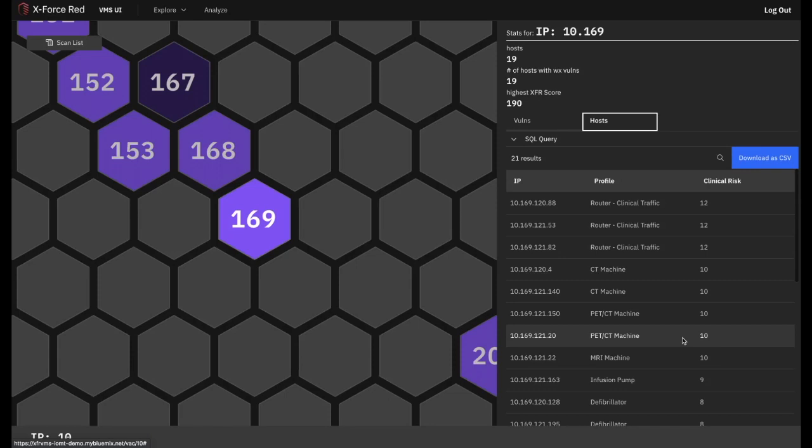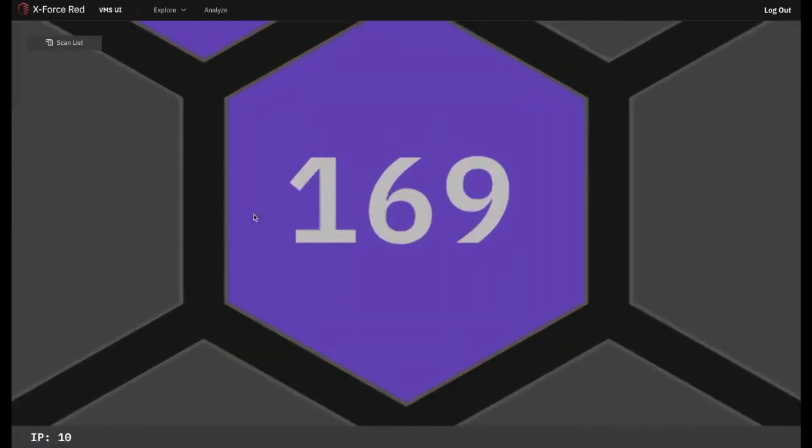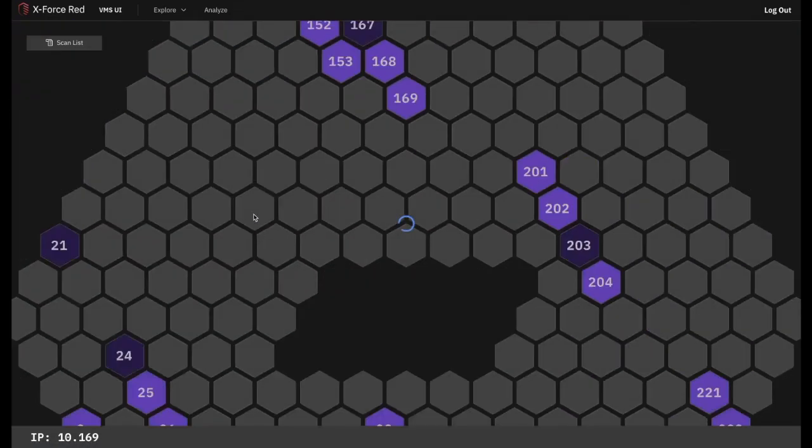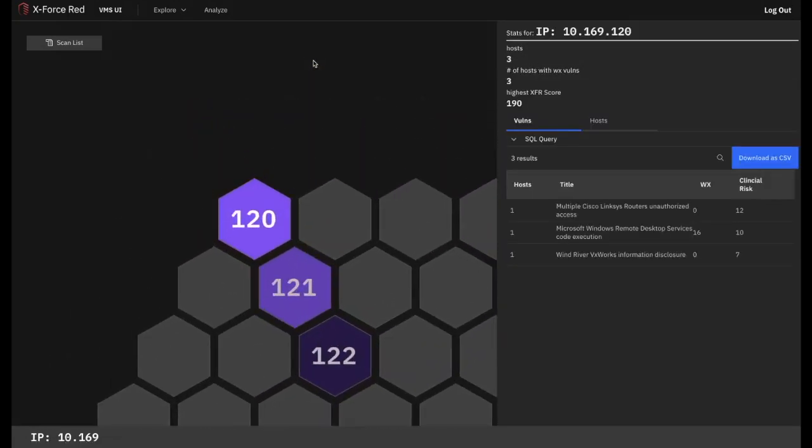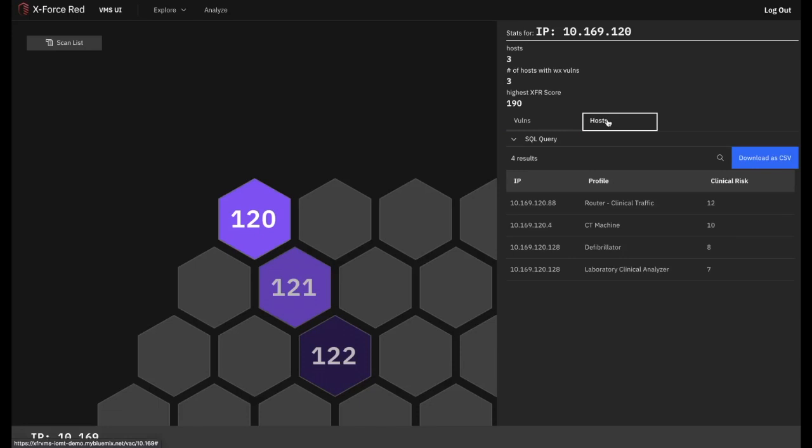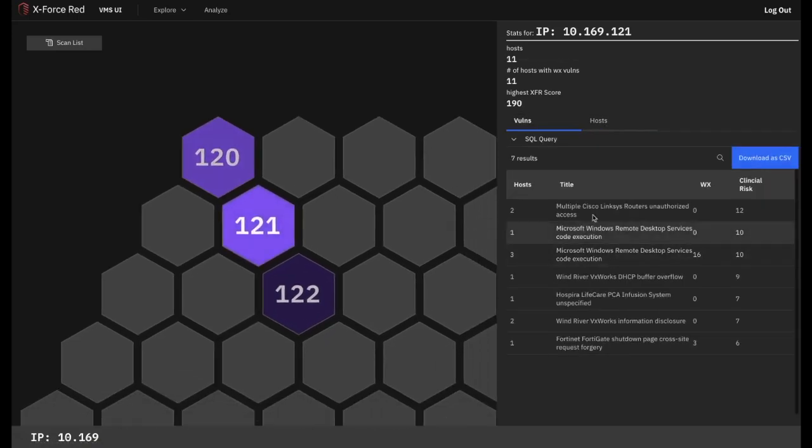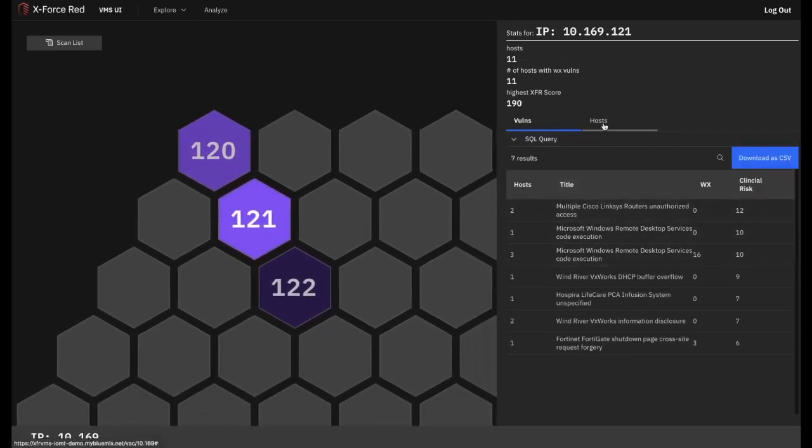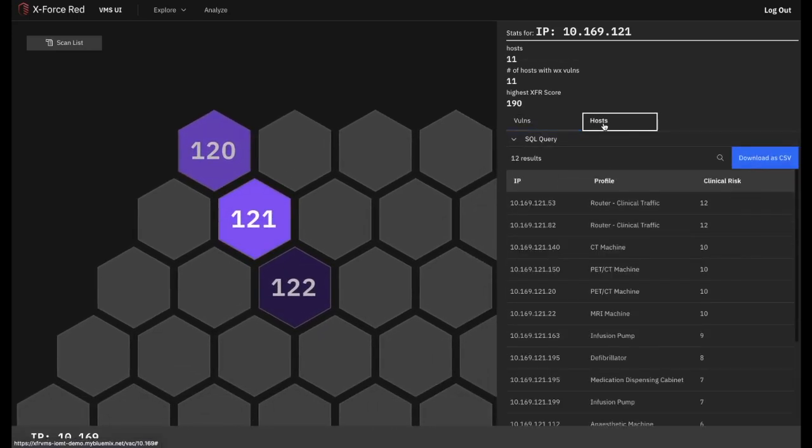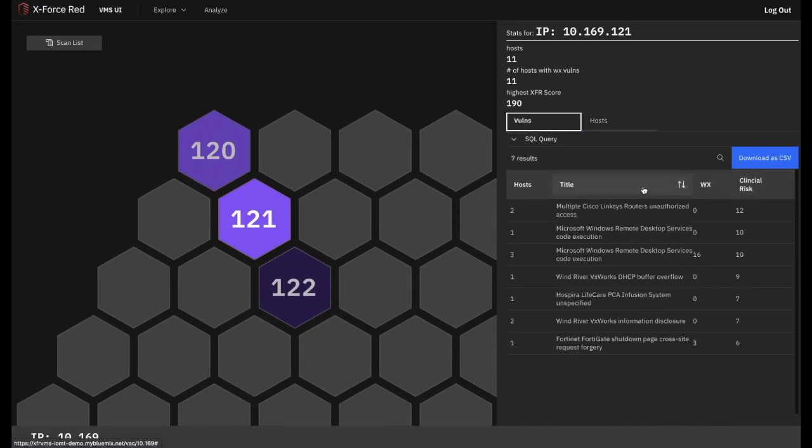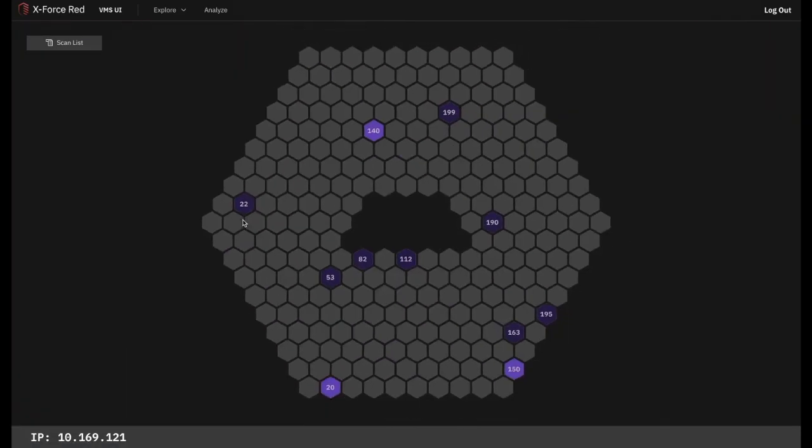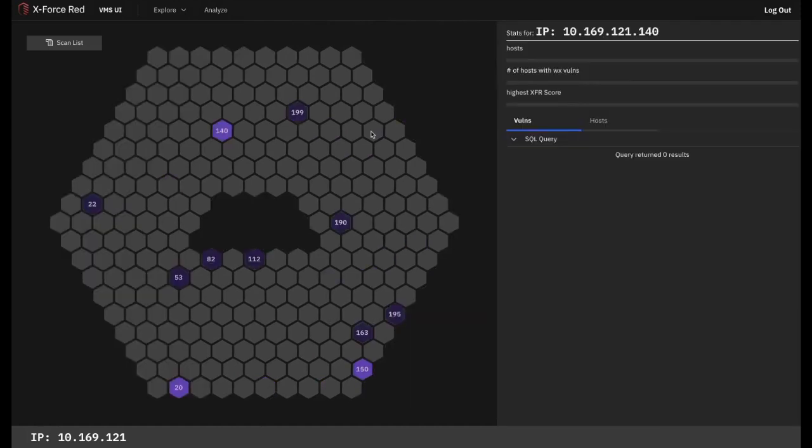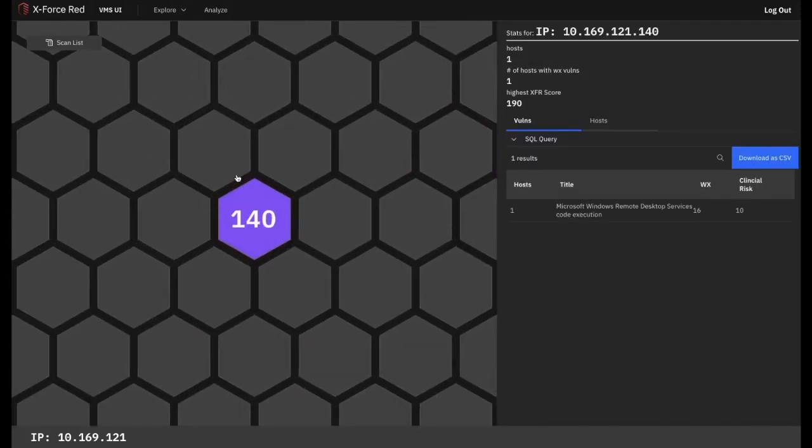So let's explore further. At the next subnet layer, we can repeat the same process as before, identifying our hotspots and reviewing the information within each of these in order to decide where the priority patient safety risks are coming from. In this case, it's in the 10.169.121 layer. We can select this to reach the individual asset layer where we will see a particular hotspot stands out brightest in terms of clinical risk. In this case, it's the asset IP 10.169.121.140.